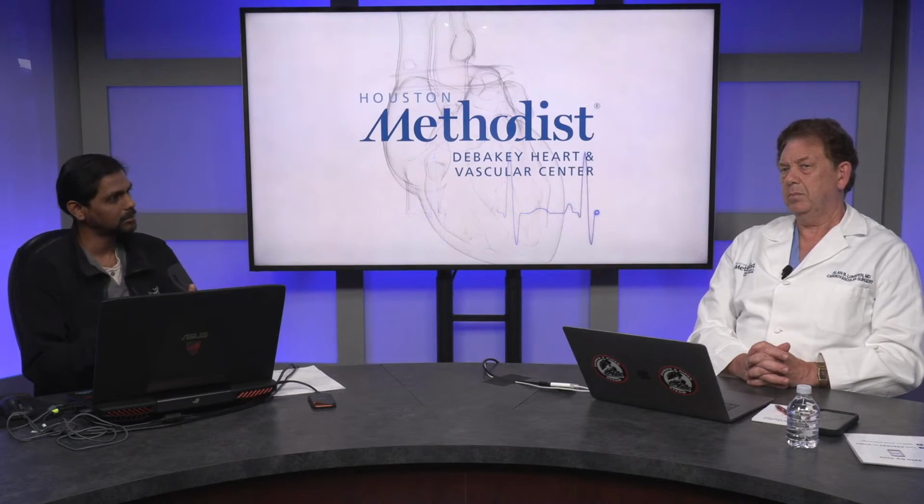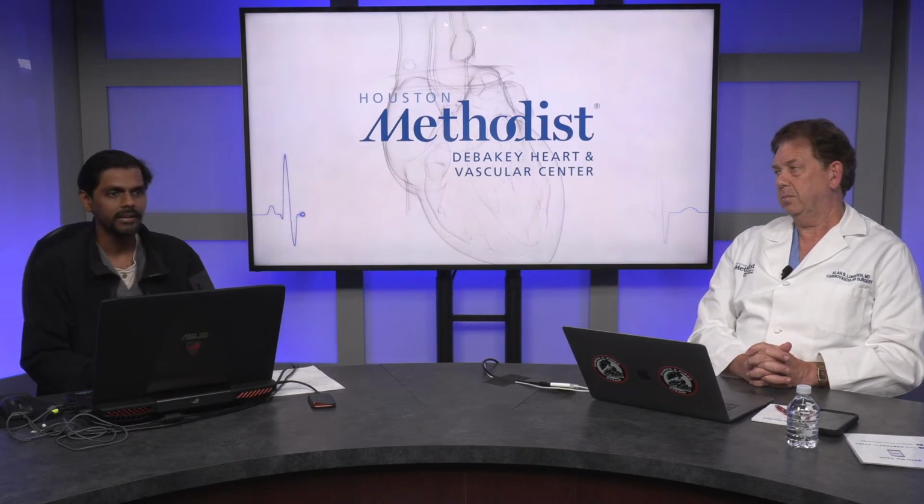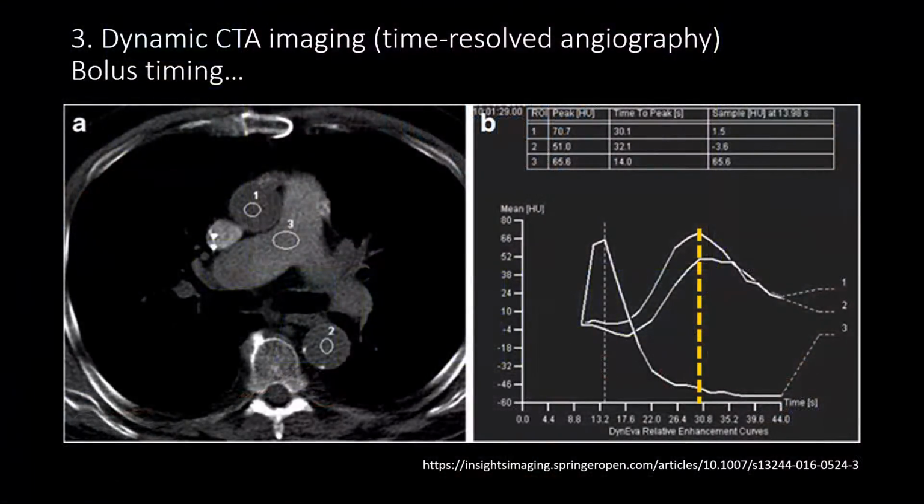Based on that timing bolus, which you can get very easily with 15 to 20 cc's of contrast, we use that timing for our actual CT imaging. There are techniques we can automate to do this. The curves on the right are dye arrival times in different locations. The y-axis is the Hounsfield unit, which is how dense the pixel is, and the x-axis is the time. This gives us a time attenuation curve, and based on this, we can decide.